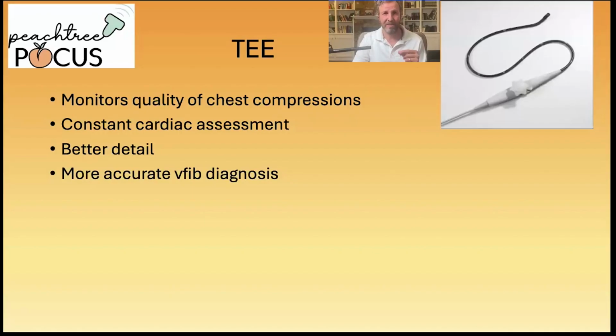Second, it provides continuous cardiac assessment. So instead of getting these quick snapshots between compressions, you're watching the heart the entire time. Third, it gives better detail. If you've ever struggled with poor transthoracic windows, which can be a struggle even when patients aren't in cardiac arrest, but especially when they are, TEE can often solve that problem.